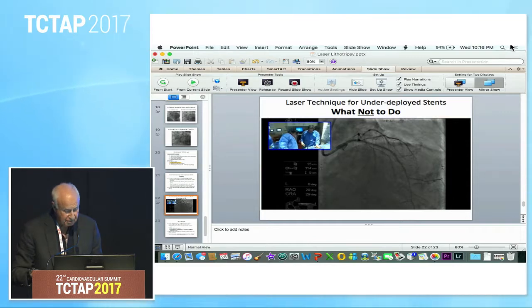This is Paul Tierstein doing a case at TCT last year, and we all know Paul's about as good as they come in doing PCI.